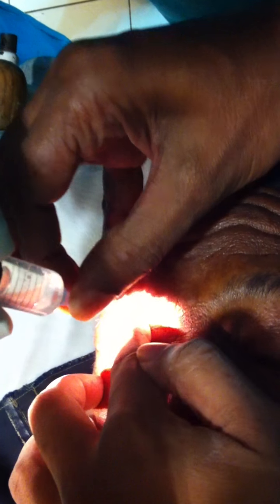You see the junction there. The bevel should be towards the globe. Now it should be vertical — maybe it should always be vertical. Tangential.